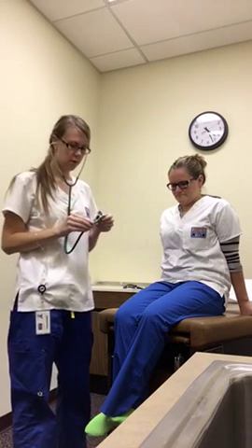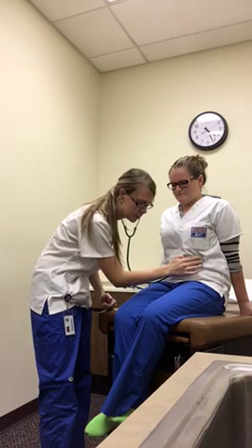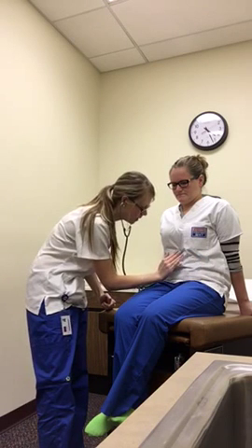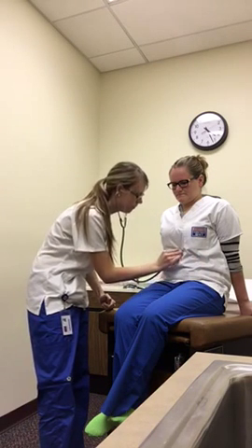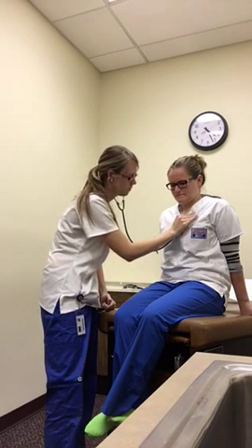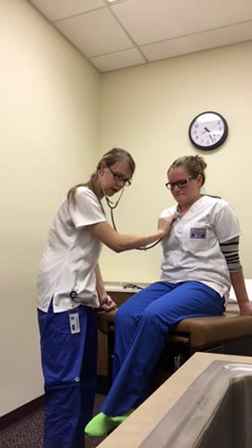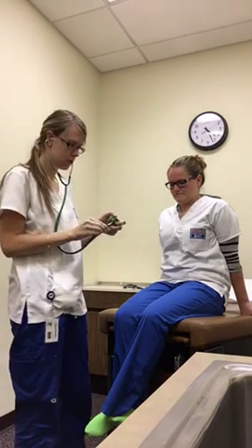Now I'm going to flip to the bell and I'm going to listen in a backward Z to all the same areas for any murmurs, starting at the mitral, tricuspid, Erb's point, pulmonic, and aortic. So no murmurs are present.